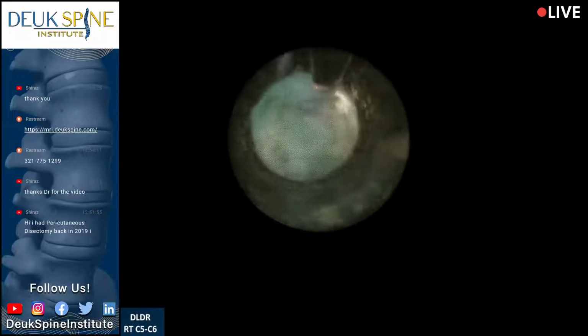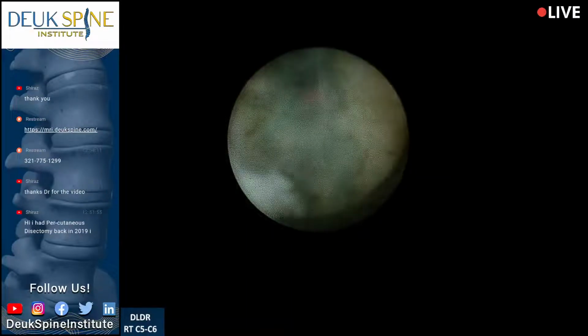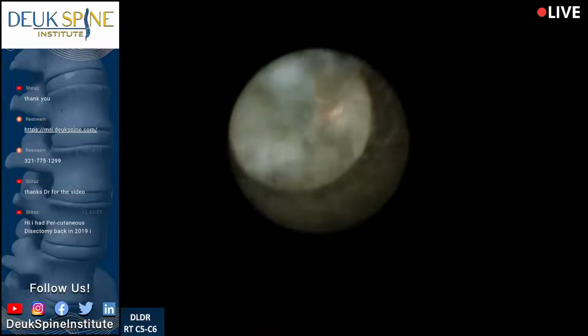You have any more questions for us, Henry? No current questions. Well, let's show people what exactly we're doing with the Deuk laser disc repair. What is this laser business all about?